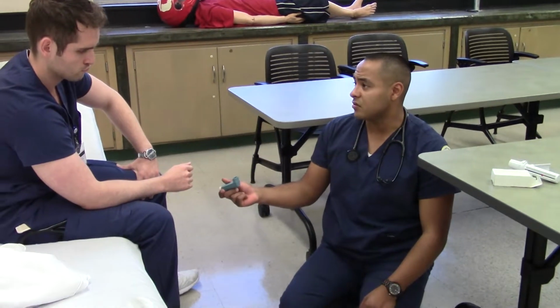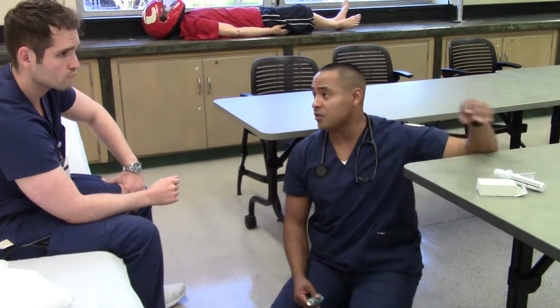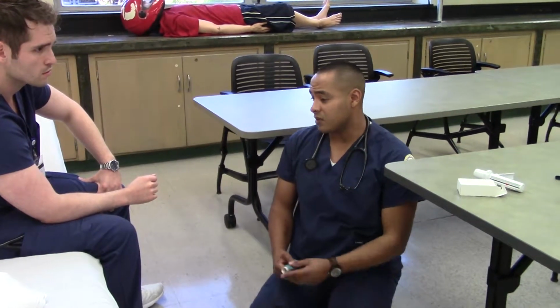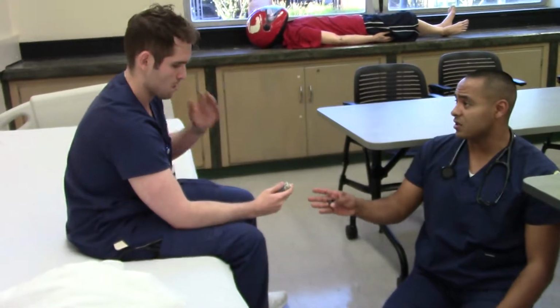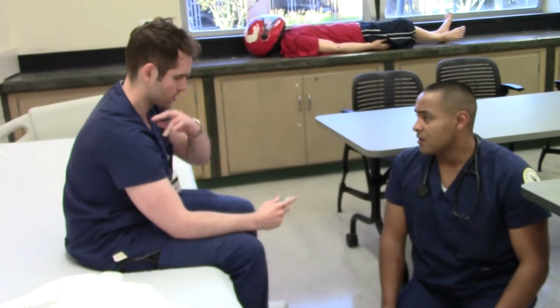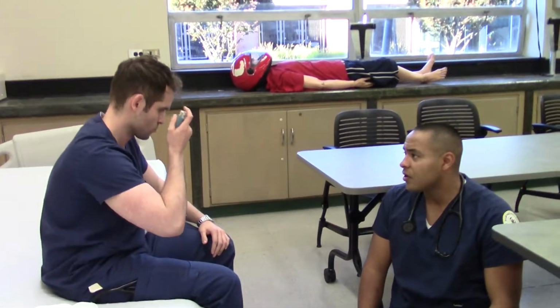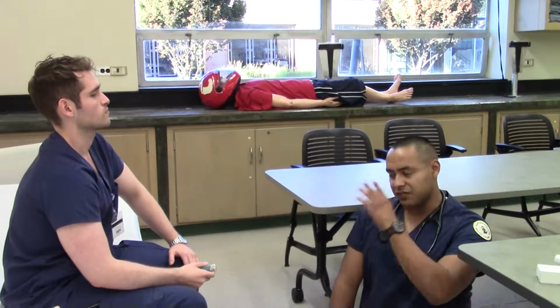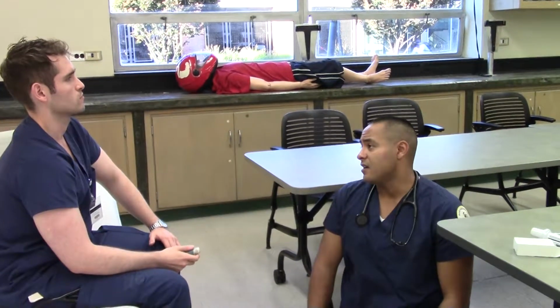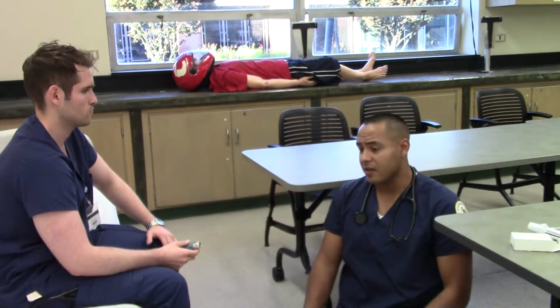Let's see how well you do. If you have problems coordinating the medication to your mouth, I'll go ahead and get you one of those spacers. Okay, but let's see how you do. So, do you have any questions before using it? No. I'll go ahead and use it. Okay. Just breathe out. Go ahead and look up a little bit. Hold on at least 10 seconds. If not, hold it as long as you can. Then from there, you breathe out through your nose. Okay.